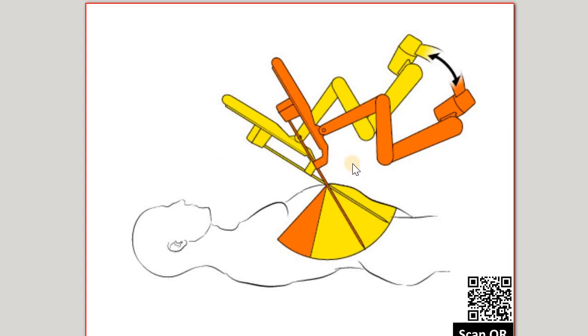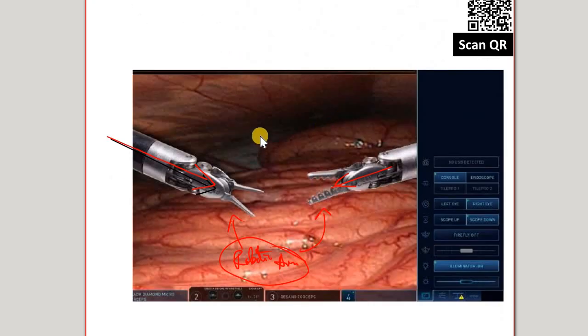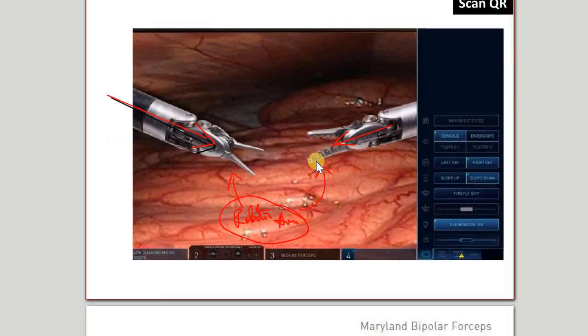And see, this is yet another plan. So this is how the operation will be done. So this is an arm. This is more or less how things will happen inside the human body assisted by the robot. And this figure I already showed you, how the operation is performed, with monitoring through the camera on one of the arms.